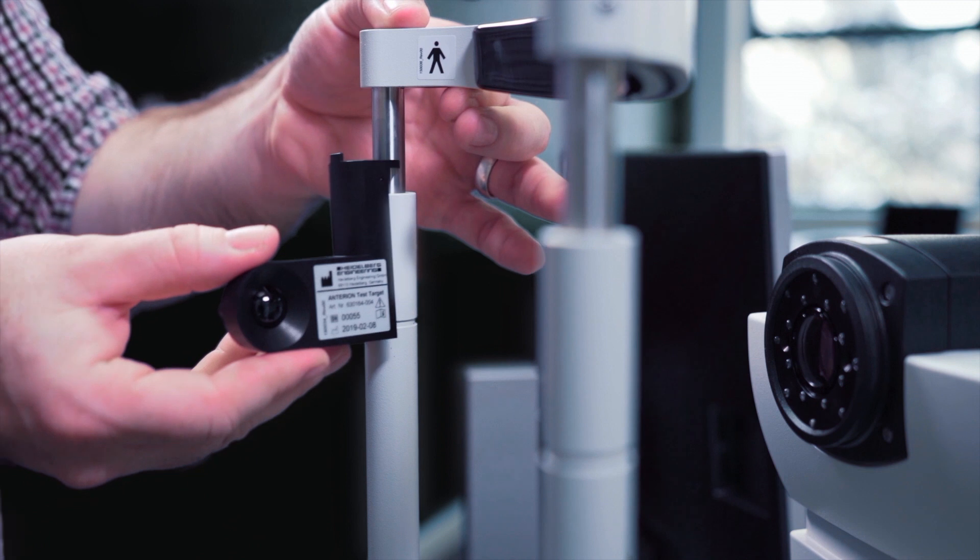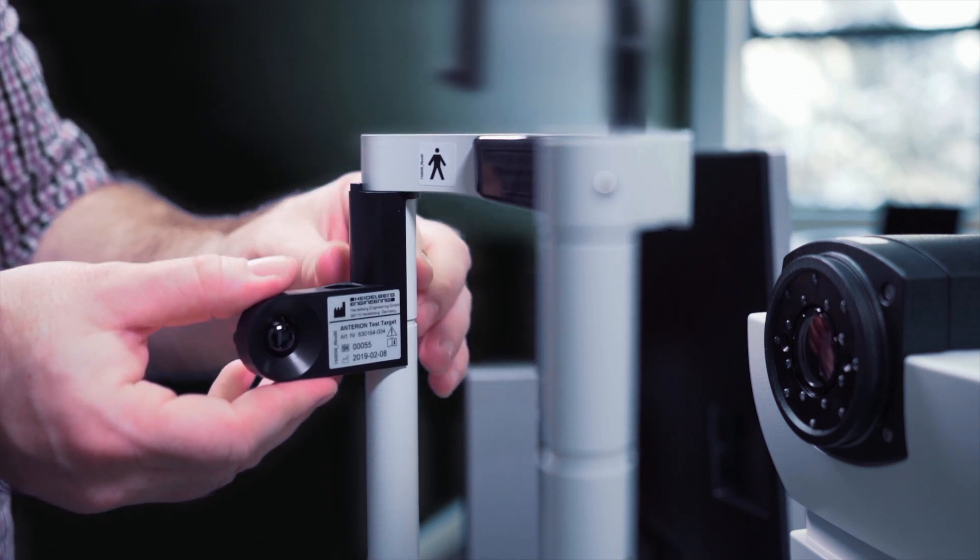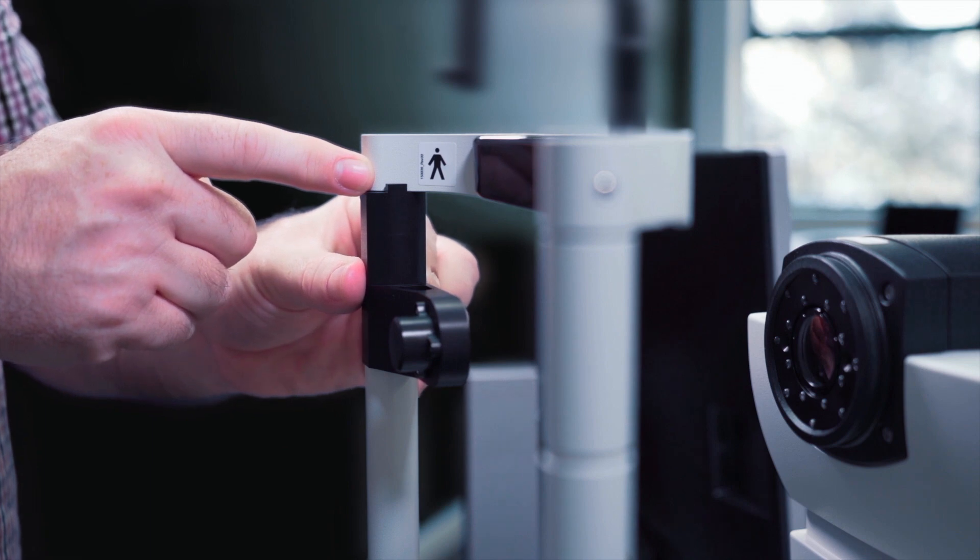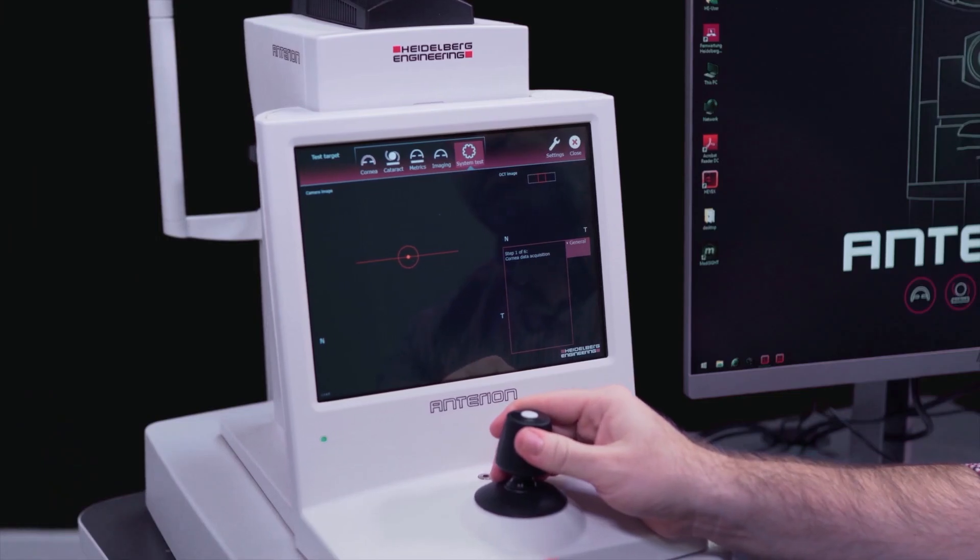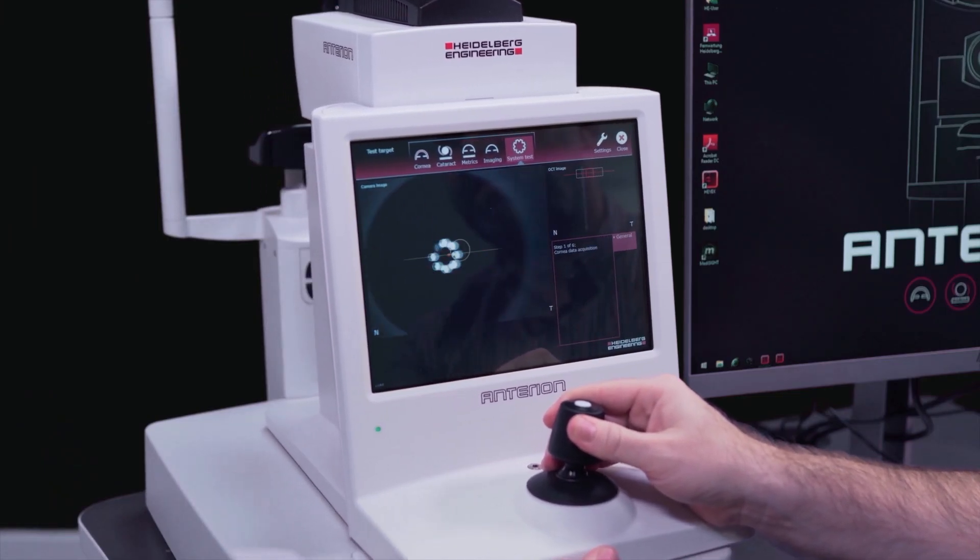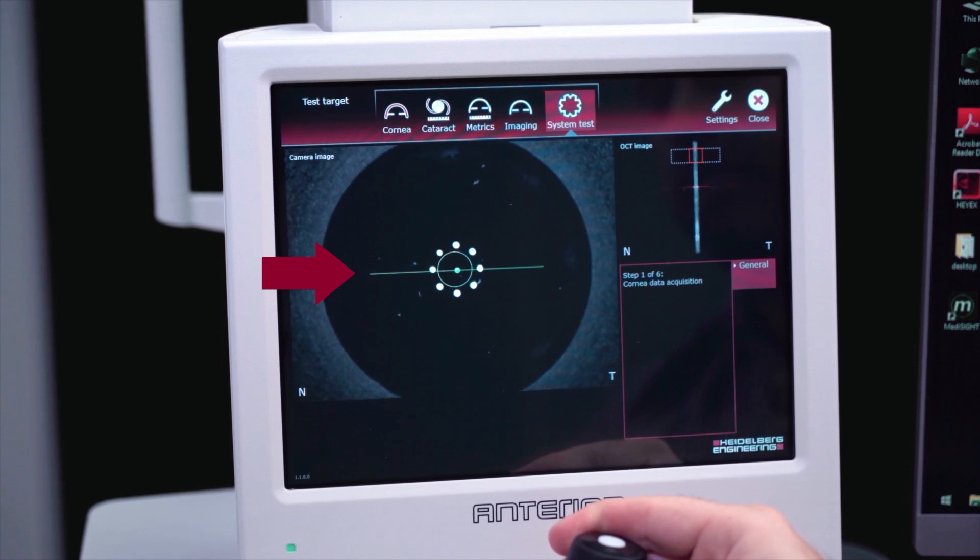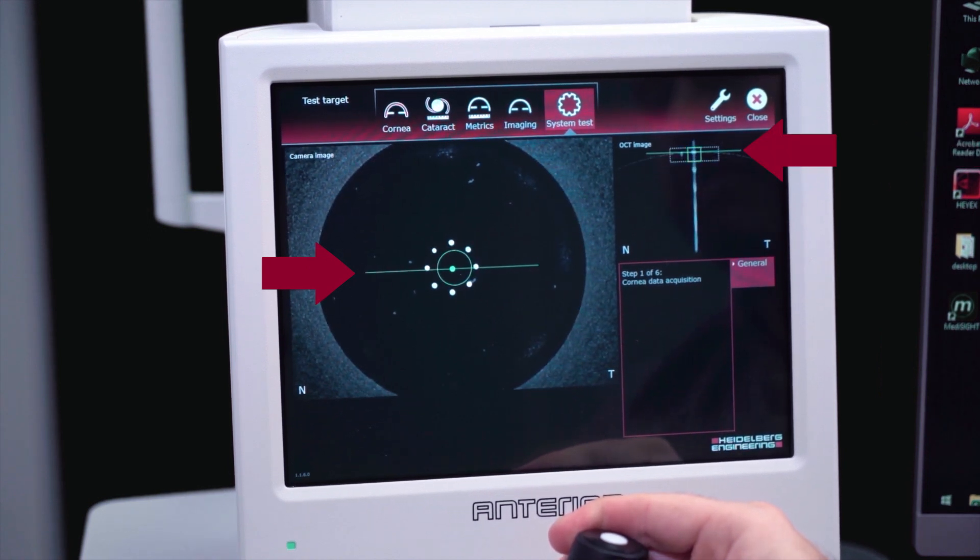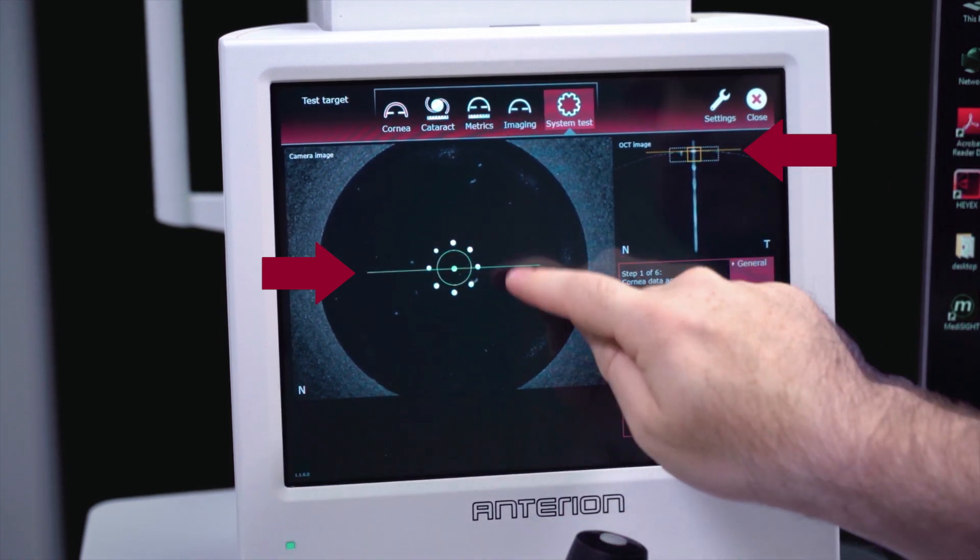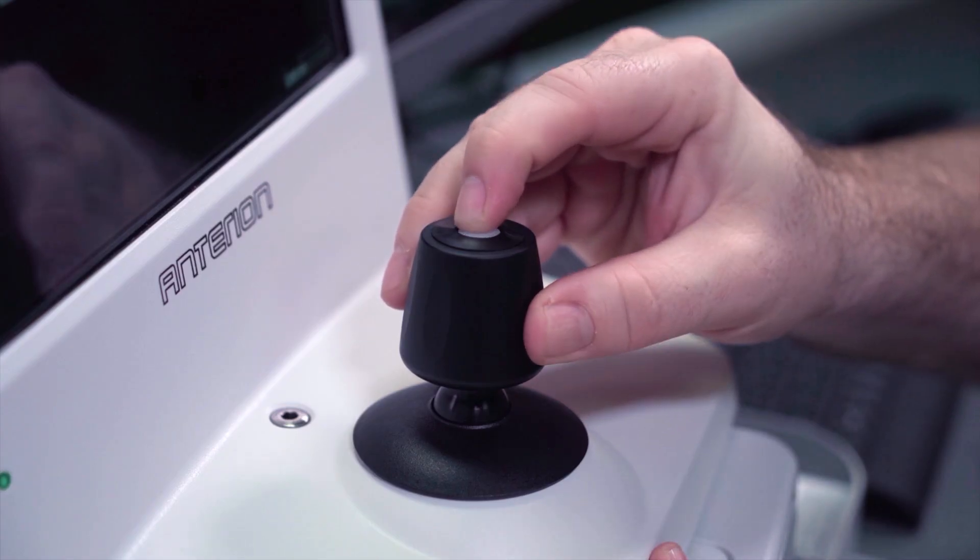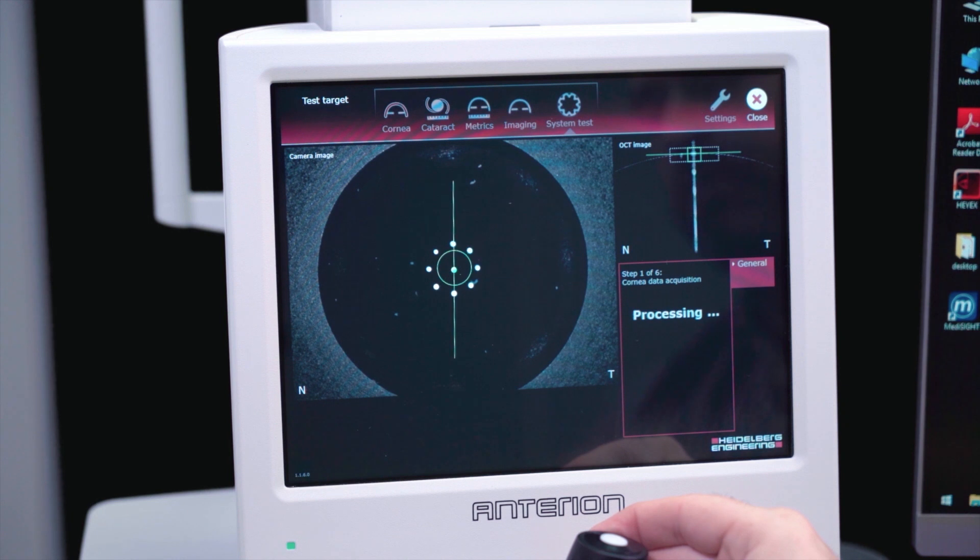Ensuring the test target is clean, we attach it to the headrest as demonstrated. To perform the system test, align the circle and horizontal line on the camera image until it goes green, and also the square and horizontal line on the OCT image. Press the joystick button to acquire the image.